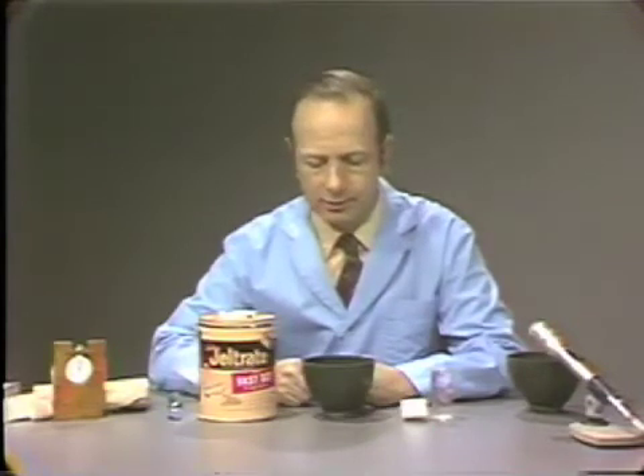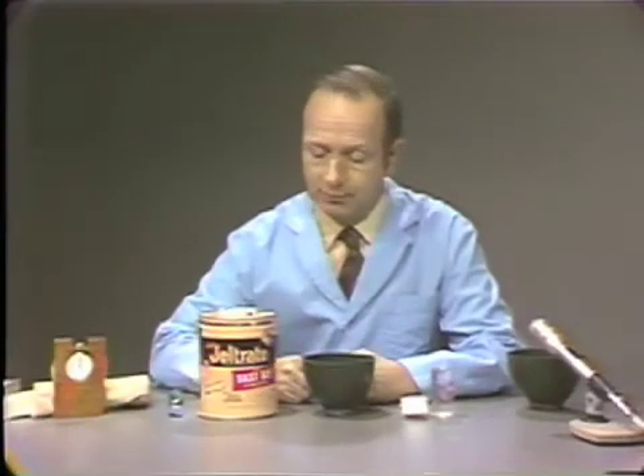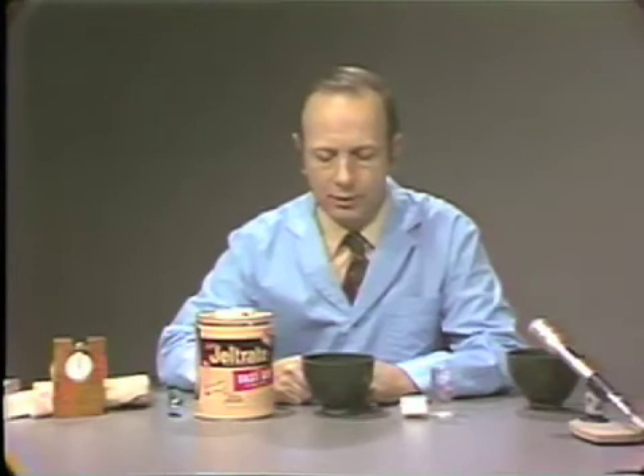There are times when a very fast set material is required, particularly when patients have a very strong gag reflex. It's highly important to leave the impression in the mouth as short a period as possible. The manufacturers supply a fast set material for this purpose. Jeltrate fast set has a setting time between one and two minutes rather than three and a half minutes, and as a result, the mixing time is now 45 seconds rather than one full minute.